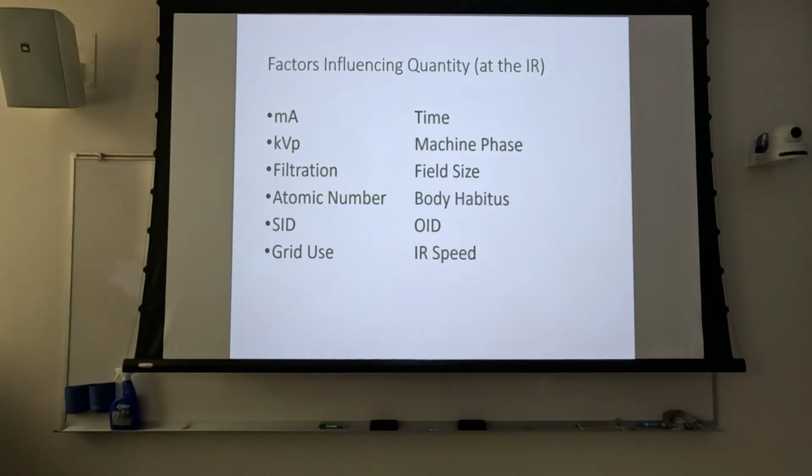to go with kVp. Realistically, in the densities that we normally deal with in human tissue, you could change your mAs, because at 70 kVp you're going to penetrate any bone in the body, but it's not best practice. So there are times we want to change our kVp, and those will be those times.